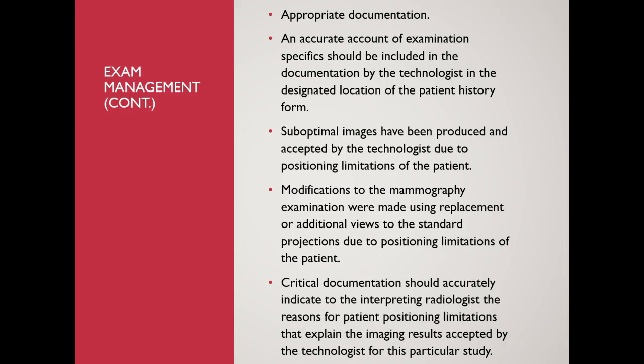Suboptimal images have been produced and accepted by the technologist due to positioning limitations of the patient. They will understand this then. Modifications to the mammography examination were made using replacement or additional views to the standard projections due to positioning limitations of the patient. So you need to make notifications of that too.